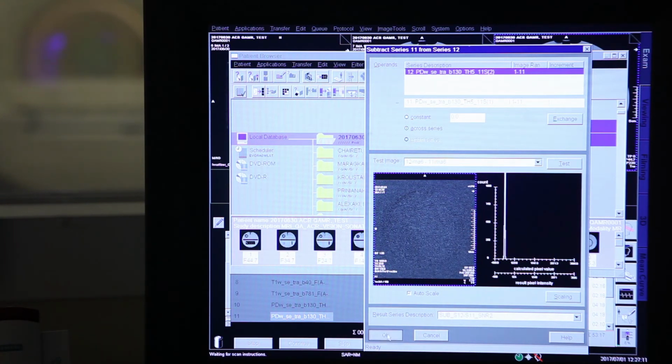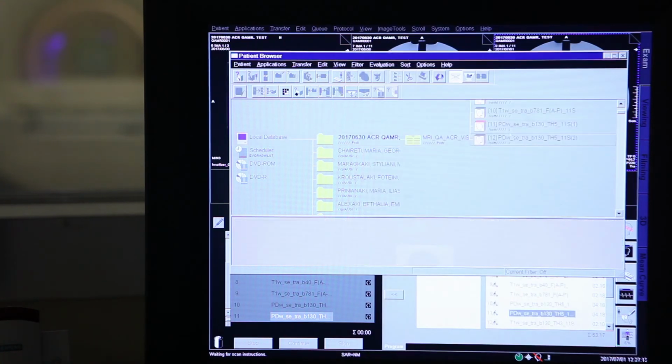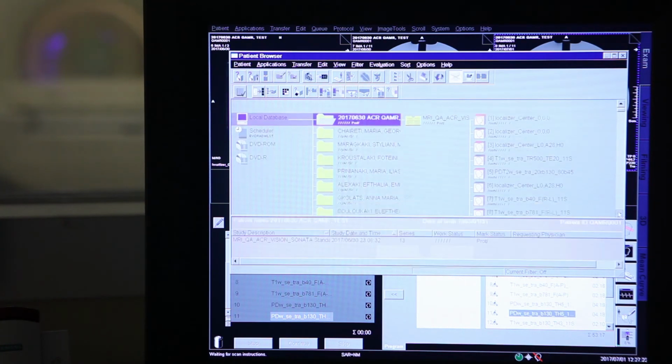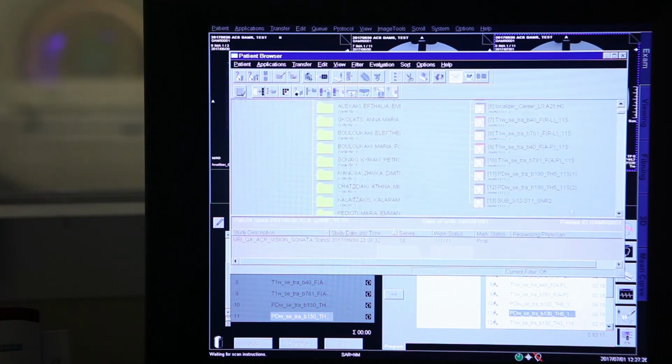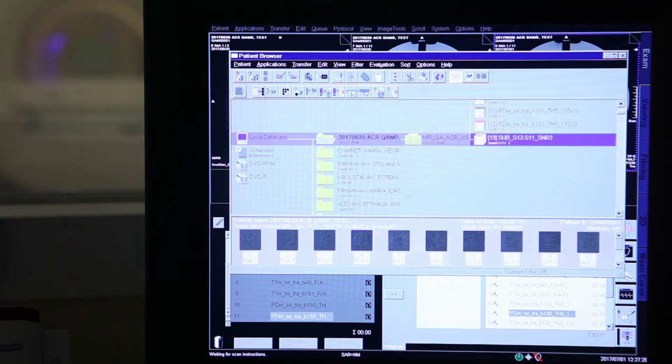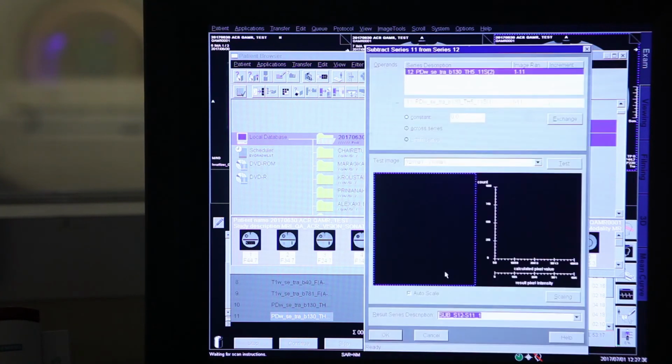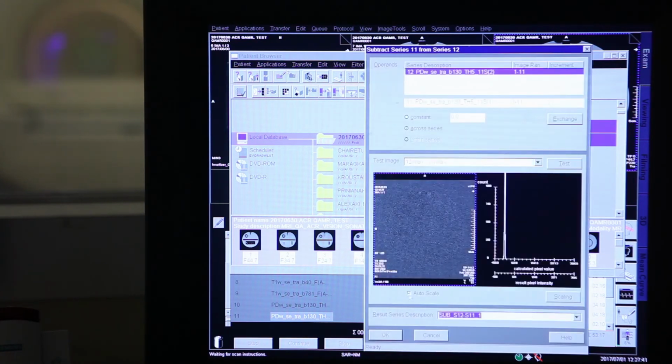Now here you're going to have two images, SNR1 and SNR2, practically. Let's do the refresh. There it is. This is the SNR2. Now let's try it again. We're going to save the SNR1, which is the unscaled image. Do it one more time. Evaluation, dynamic analysis, subtract again. We're going to test. Take this image, and I'll put it as SNR1 to remember.